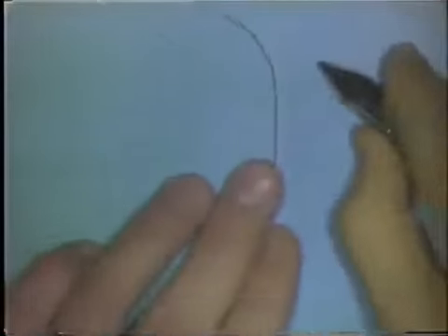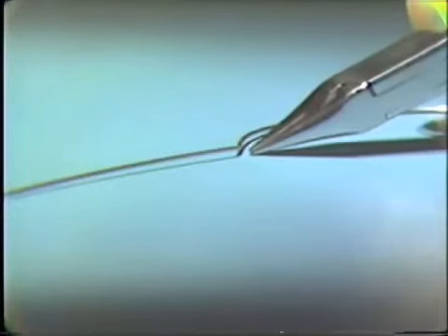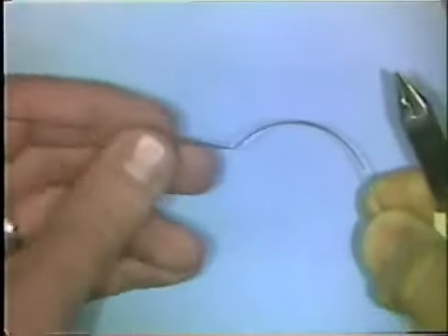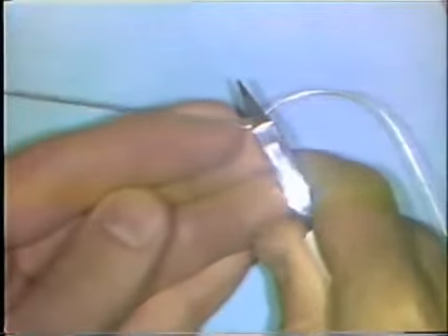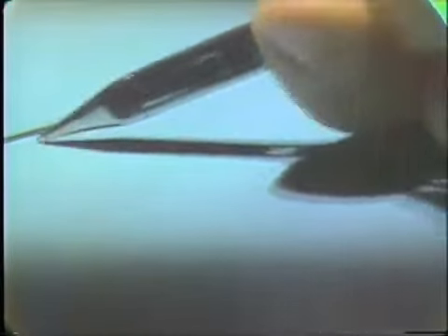Now you know that your curvature was flat before, and it leaves the table now at the point where you place the last bend. This means that the lack of adaptation to the tabletop is due to this last bend that you've placed in. To correct this, you place the wire in the beaks of the plier and make a slight upward bend, and try it again on the table surface. And sometimes more than one upward or downward bend is needed to adapt it to the table surface. But now this leg of wire is in the same plane of space as the curvature. Now we can complete the 90-degree bend to form the first half of the loop.